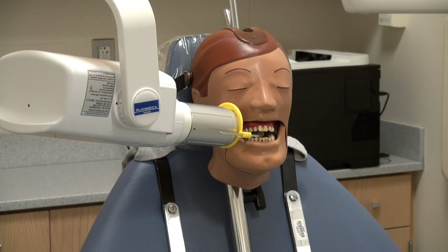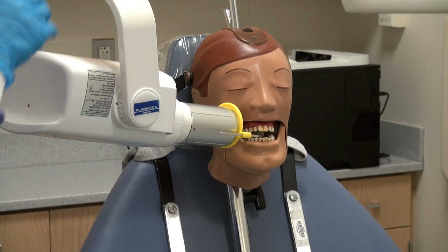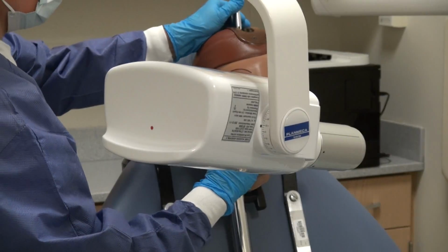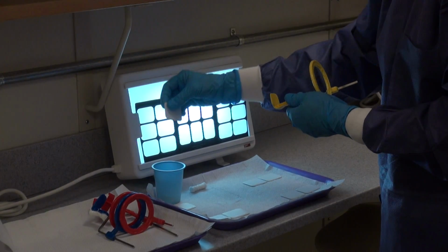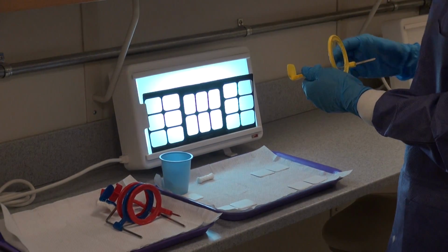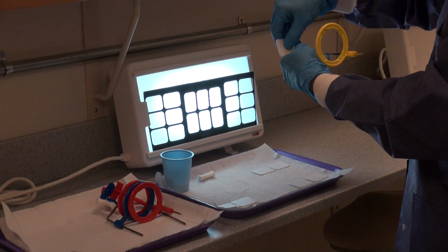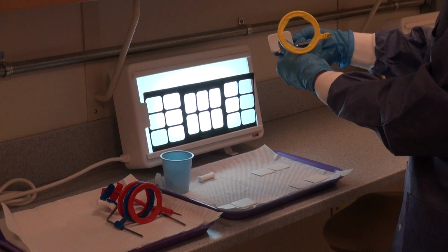So go ahead and push the button and use the warning signal. Clear! As soon as you are finished making the exposure, come back in and remove the film from the patient's mouth. Place the exposed film in the disposable cup on the tray and pick up the next film for the right maxillary molar image using the same XCP setup.